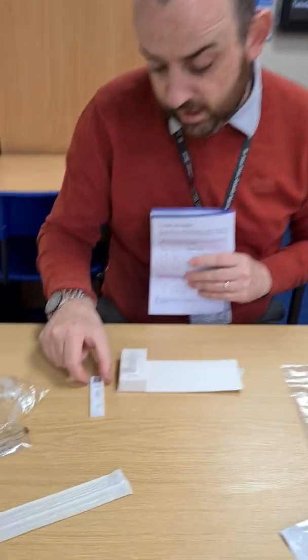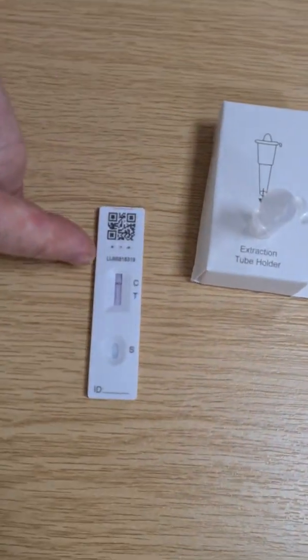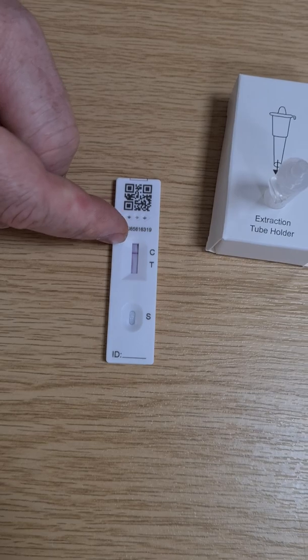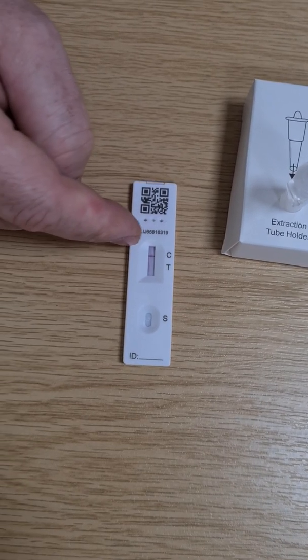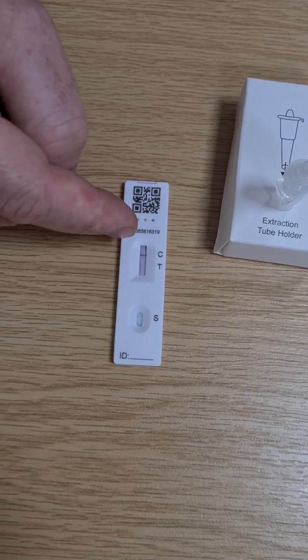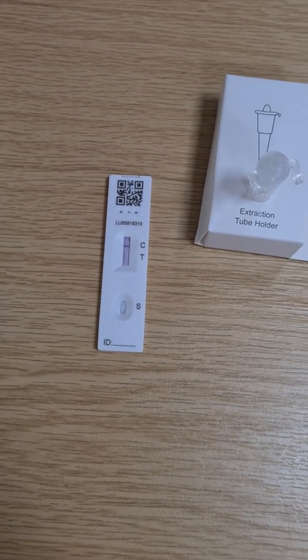Zooming in now, after a couple of minutes since putting the drops in, you can start to see that red line forming next to the C, indicating this has been a successful test. Now we wait the full 30 minutes to see the outcome of the result.